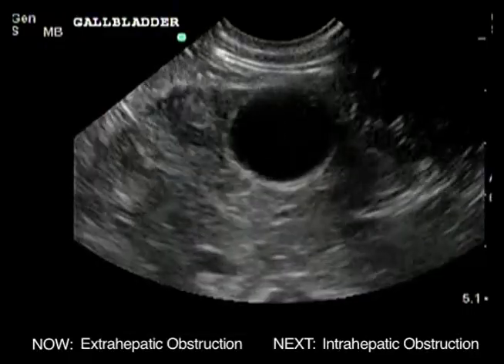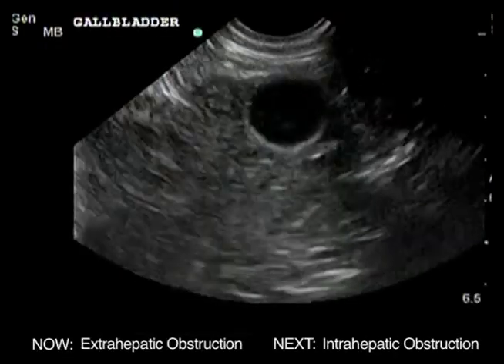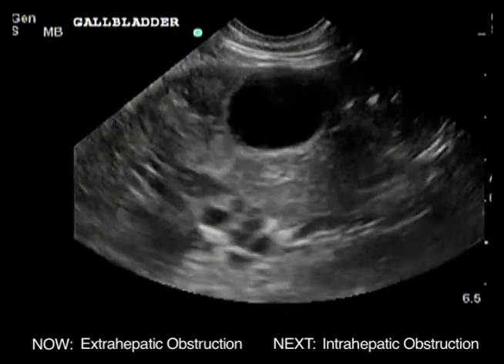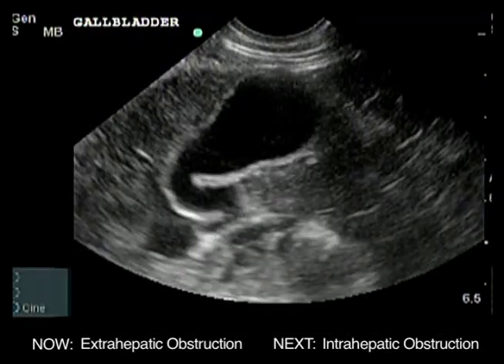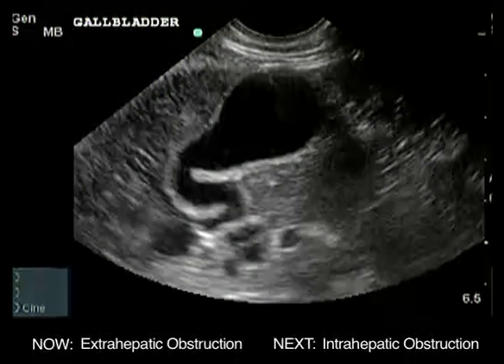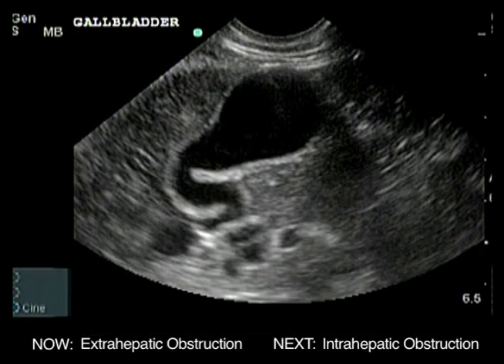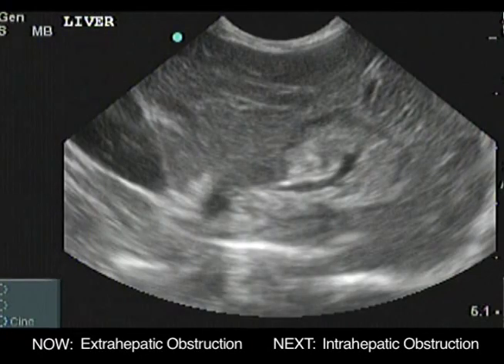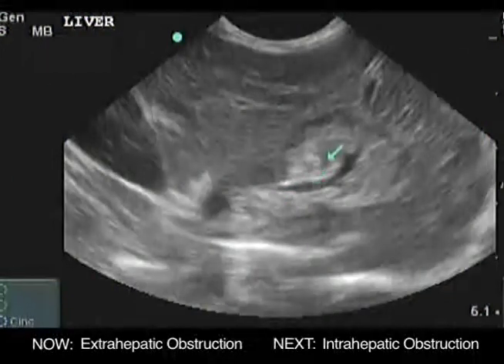Intrahepatic bile ducts are not normally seen in dogs or cats. Enlargement of the intrahepatic bile ducts indicates a current or past biliary obstruction. On ultrasound, this is known as too many tubes, as seen below the cystic duct in this video. Note the hyperechoic liver parenchyma surrounding the dilated intrahepatic bile ducts in this transverse view of the liver of a dog with extrahepatic biliary obstruction.